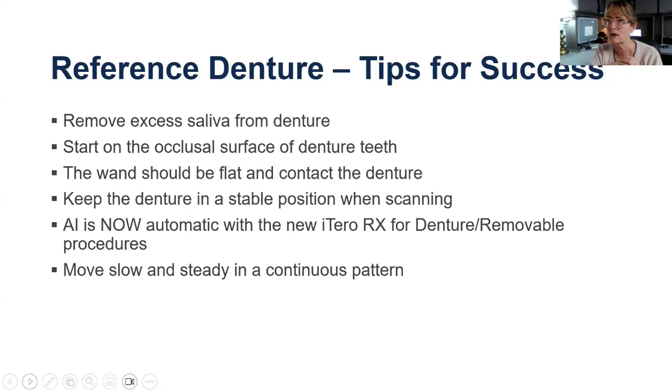And to be very, very honest, when I explain to a patient, I ask them if they've ever had an impression taken before. If they had an existing denture, I bring up the obvious. I'll say something like, well, I'm certain that you had a physical impression taken before when you had your original denture made. Today, we're not going to do that same process. We're going to take some pictures of your mouth with the scanner camera, and then I show them the camera. Most of the patients are thrilled. They're so excited that they're not going to have a traditional physical analog impression taken.